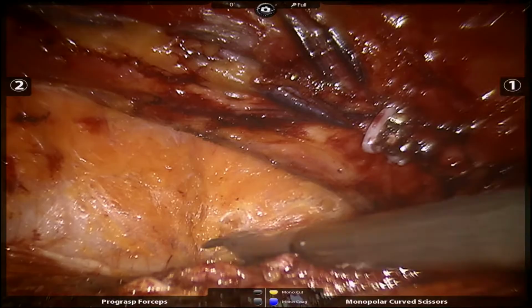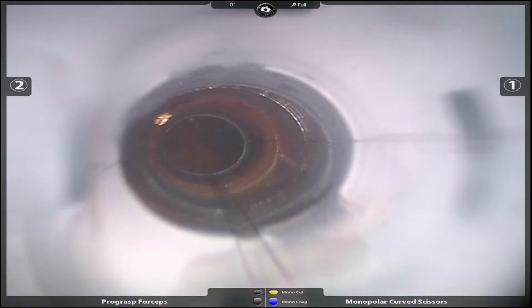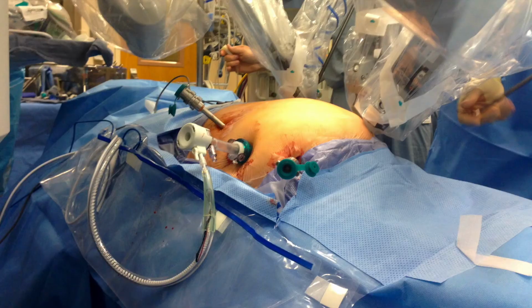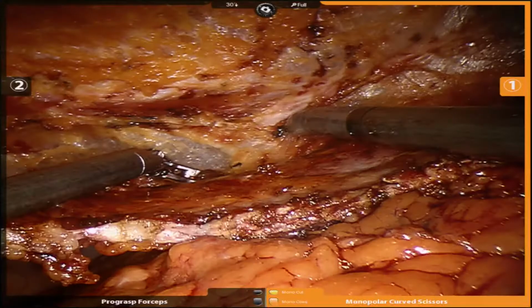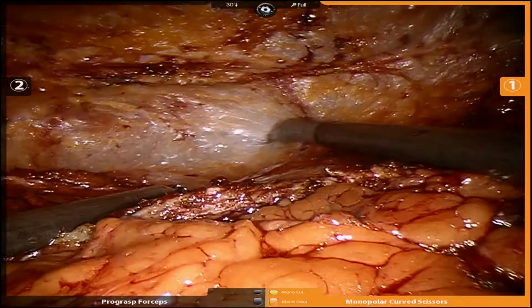Once adequate mobilization is achieved, the robot is then undocked, the patient is turned 180 degrees, and mirror image trocars are placed on the opposite side for contralateral dissection. Seen here is contralateral dissection subsequent to the incision of the linea semilunaris within the interparietal plane between the internal oblique and transversus abdominis.